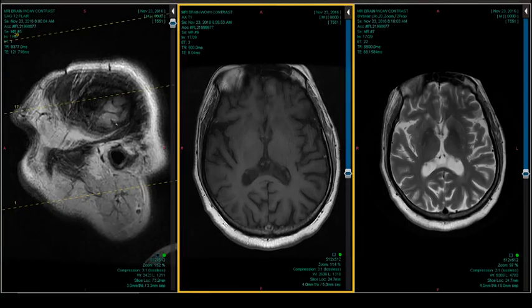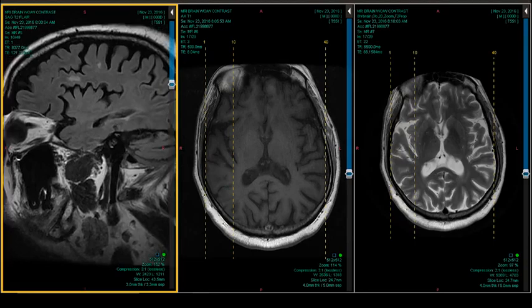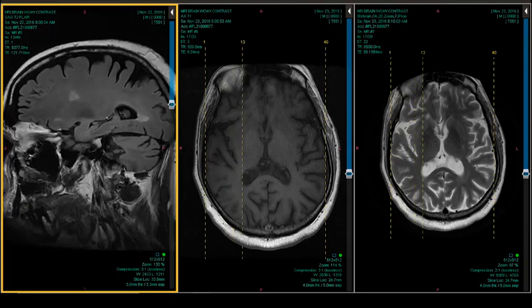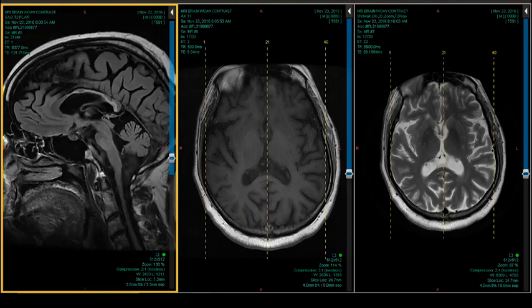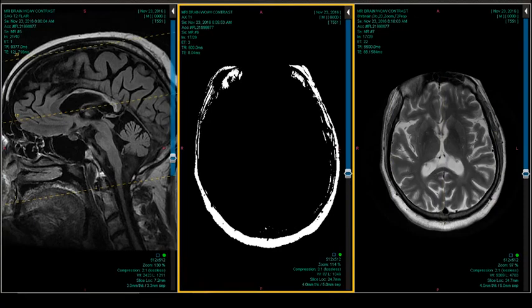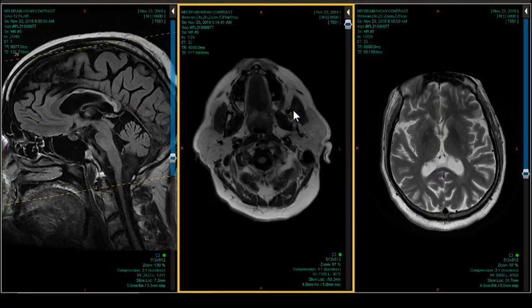Remember, this is one of the tauopathies that we discussed earlier: frontotemporal disease tauopathy, Alzheimer's disease tauopathy, PSP, corticobasal degeneration. All right, so I'm putting up a sagittal, as I usually do. This time I've got a sagittal FLAIR, which I have magnified in deference to Alex. And I think I'm going to get rid of my axial T1. I'll put up my axial FLAIR.